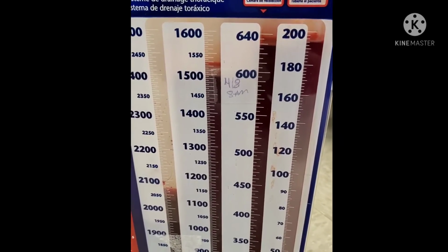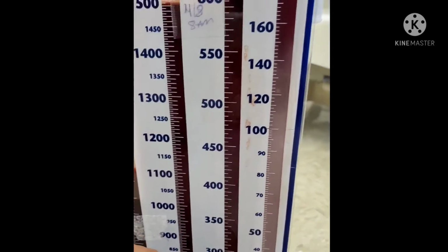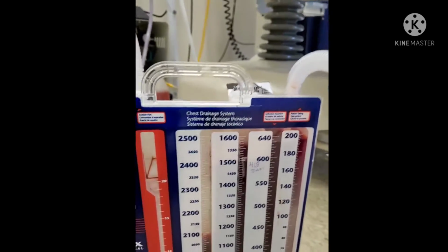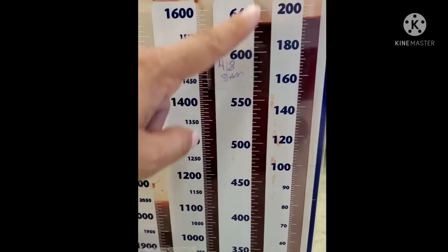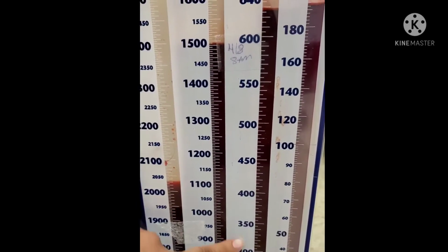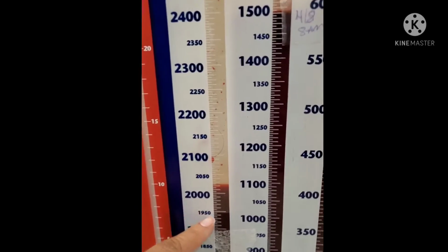Now, the drainage chamber starts off down here. This would all have blood in it. Somebody must have tipped it over, and so it looks like there's no blood. But this would have blood in it, because what happens is that the blood starts here, goes all the way up, and after it fills up to the top, it's going to start draining into this chamber, and then it's going to go all the way up and then drain. So it's all the way over here.